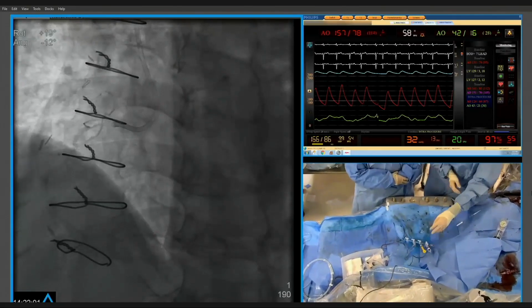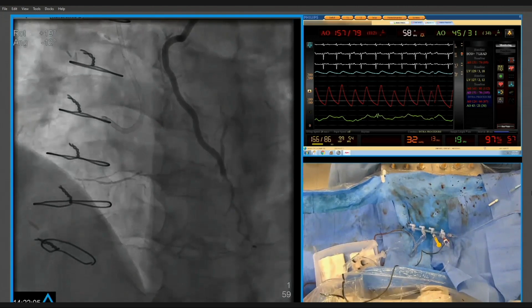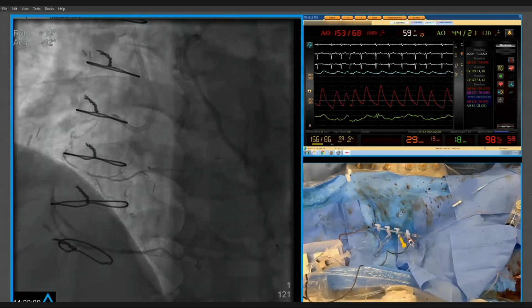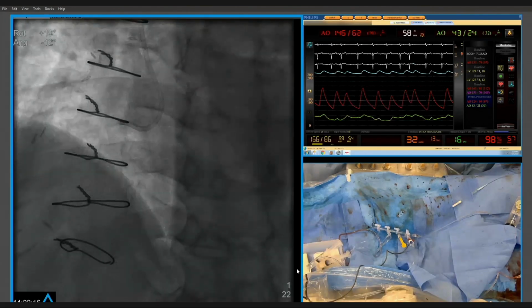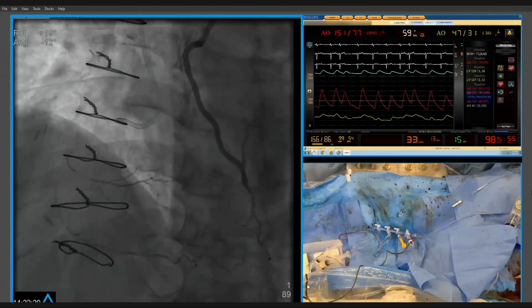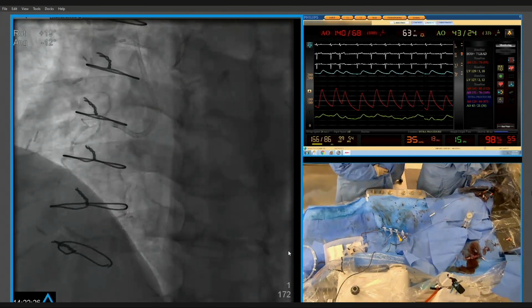But the shot from the LIMA now, interestingly, fills much, much better than we saw before, because it's a more direct engagement of the LIMA. So just the angiography alone, it's a great teaching point, is much, much better at this point than it is in the setup shots. And what you can see here is that there are two marginals that fill. The occlusion is shorter than it appears. You also see the bifurcation filling in, then it fills back to there. So it's a relatively short occlusion that's less ambiguous or blunt than it was before. And you can even see the graft tenting site to where to go.